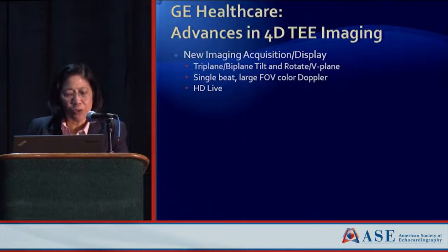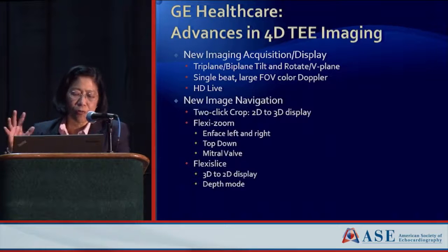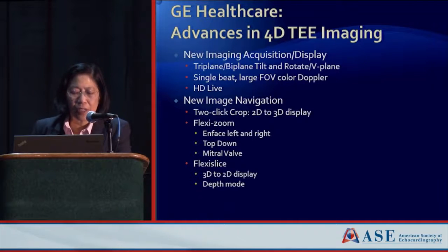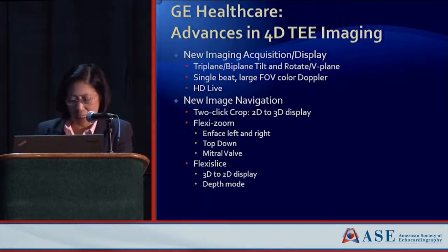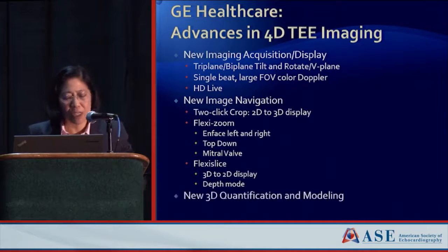What I'm going to show you are some of the new imaging acquisition and display modes, including triplane, biplane, tilt, rotate, v-plane, single beat, large field of view, color Doppler, and HD Live. For new image navigation, we have the ability to do a two-click crop, which makes cropping of the 3D very intuitive. We also have tools called Flexi-Zoom and Flexi-Slice — ways of navigating around the image.